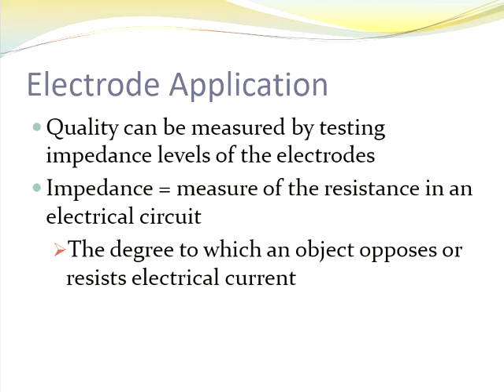So essentially, think of it that when we're prepping the skin, we're getting rid of dead, dry skin, physiological matter that could impede the electrical signal from the brain or the muscle or whatever we're trying to record, and it blocks that electrical signal from reaching the wire, which then travels to our system.